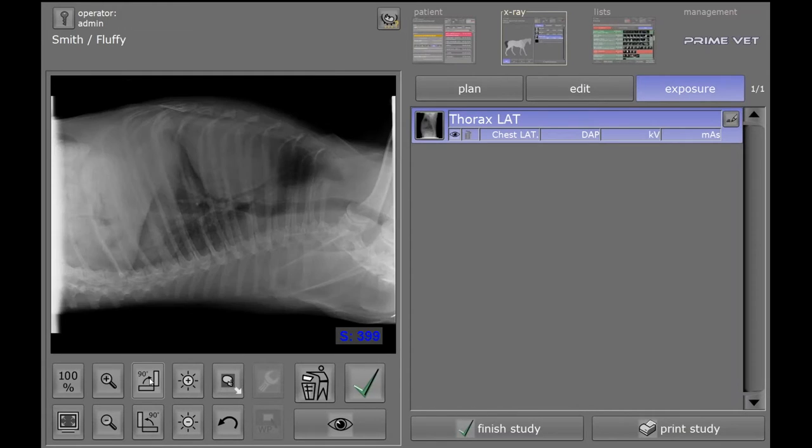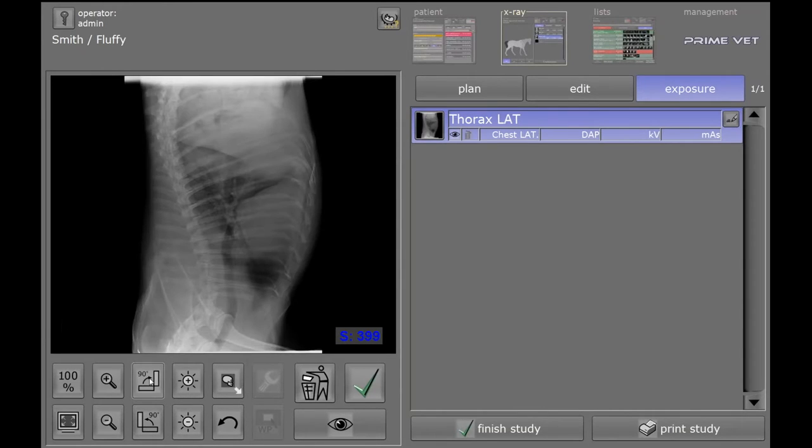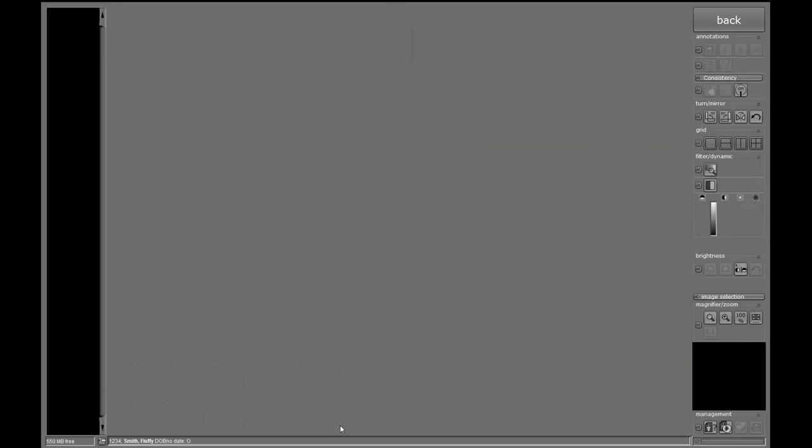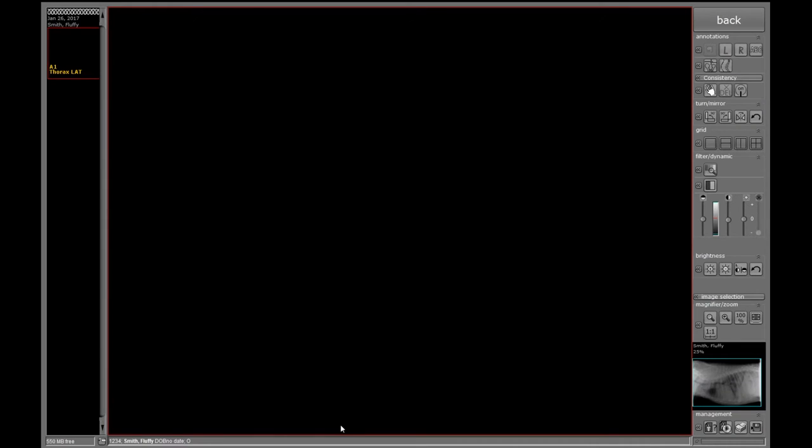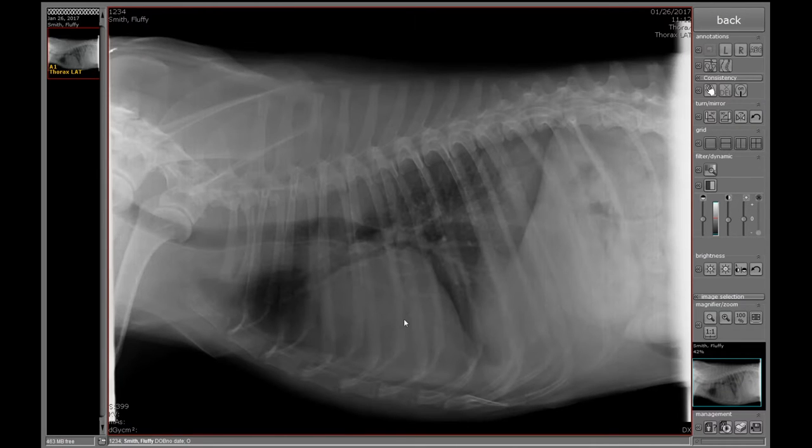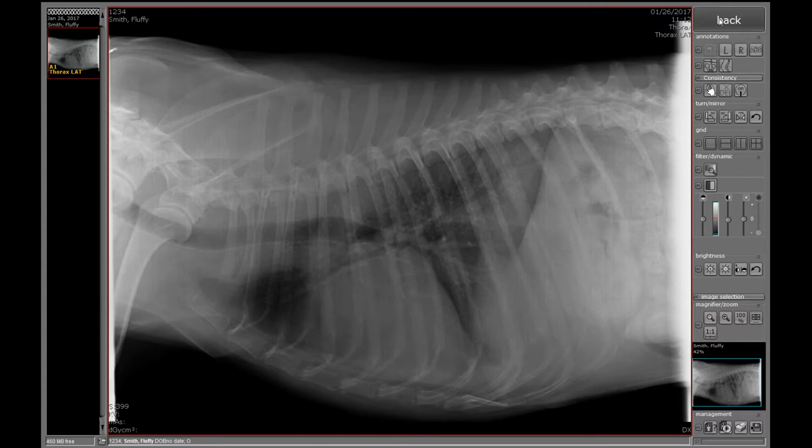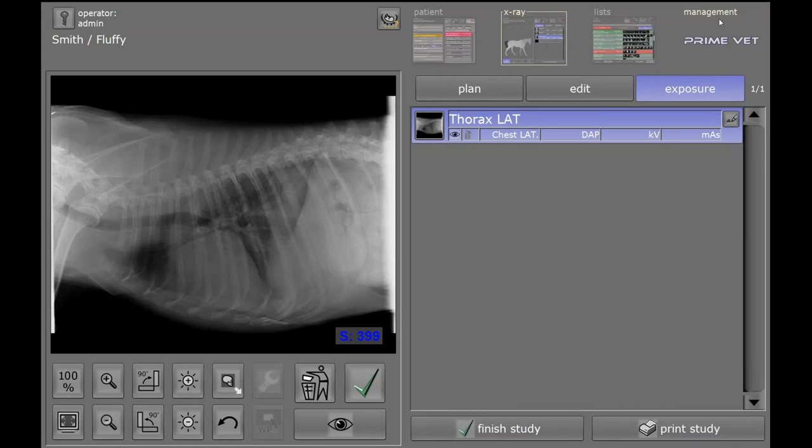From here, we can rotate 90 degrees clockwise or counterclockwise, get our image. Once again, if we click on the I, it'll launch our full-blown viewer with all the different tools that you need on the right-hand side. Clicking back will bring me back to the Exposure mode.